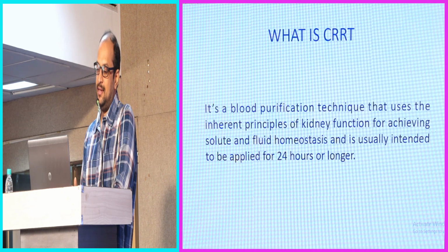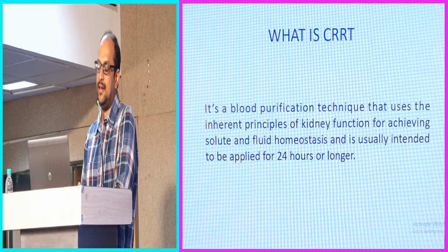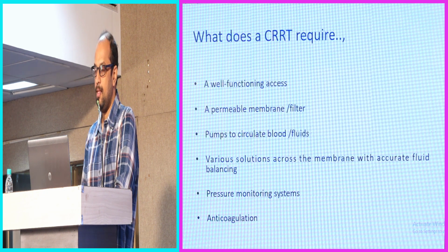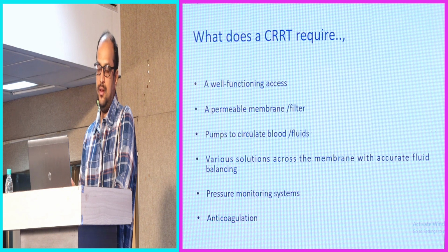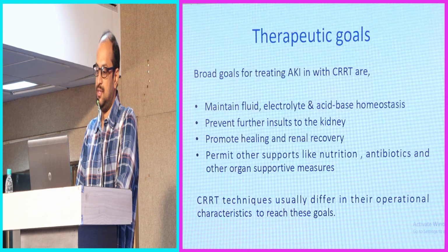So what is CRRT? Many of us know that it is a blood purification technique that uses the inherent principles of kidney function for achieving solute and fluid homeostasis, and it is usually intended to be applied for 24 hours or even longer. So what does a CRRT require? A well-functioning access, a permeable membrane or filter, pumps to circulate blood and fluids, various solutions across the membrane with accurate fluid balancing, pressure monitoring systems, and anticoagulation.